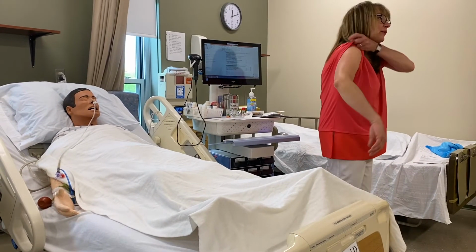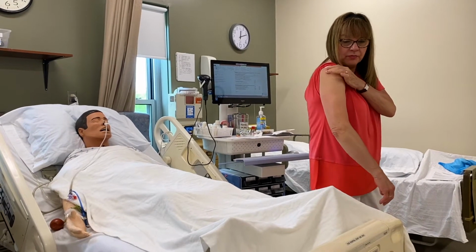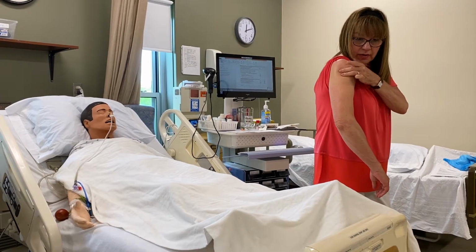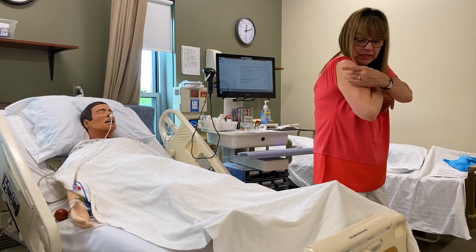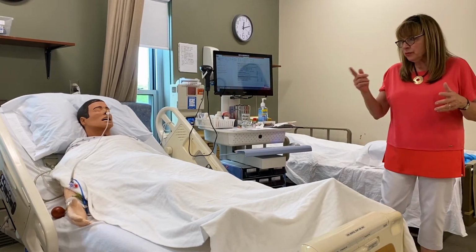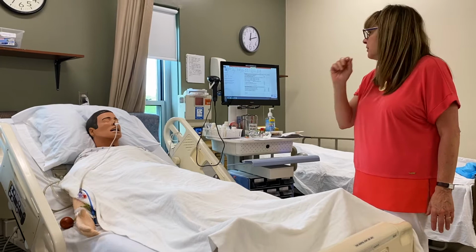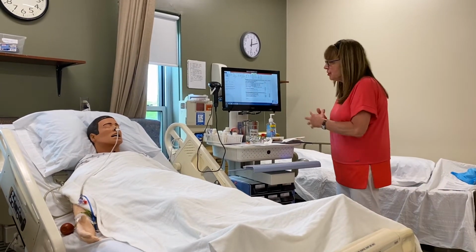I didn't talk about the palpatory landmarks for the deltoid, but the acromion process is where you're going to palpate that bone. And then 2 to 3 fingers below is where your deltoid muscle is. And if you lift it up, you can see it. It's kind of shaped like a triangle. Now, when you do your ventral gluteal, we're going to demonstrate on the mannequin, you have to palpate the head of the trochanter and abut the anterior superior iliac crest or spine. And we'll show you on the mannequin.